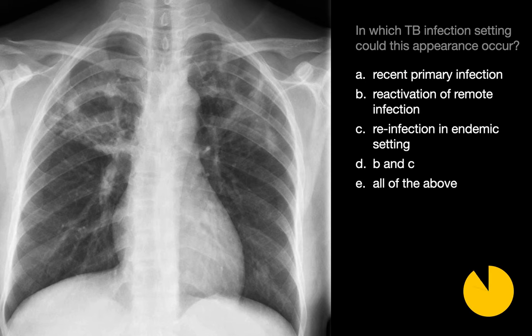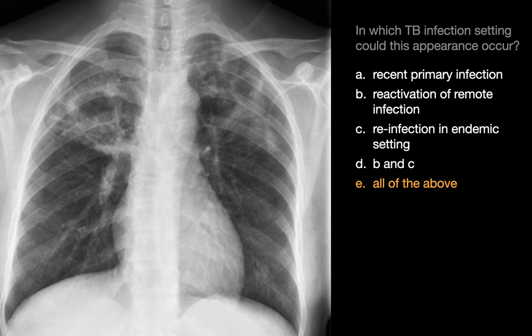In which TB infection setting could this appearance occur? It turns out that any of these situations — recent primary TB infection, reactivation of remote TB infection, or TB reinfection in an endemic setting — could result in a fibrocavitary upper lung infection pattern like we see here.